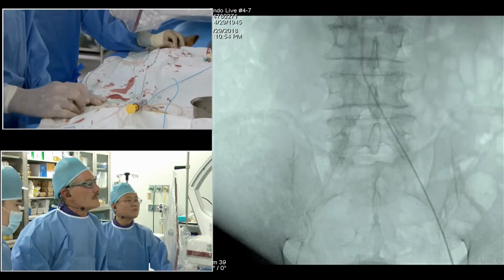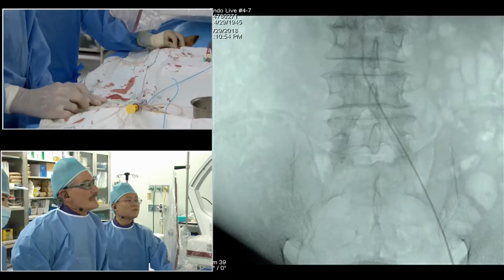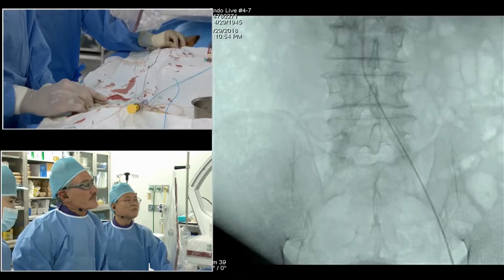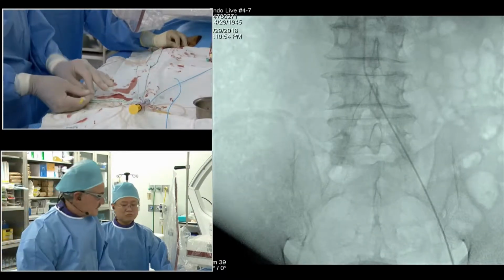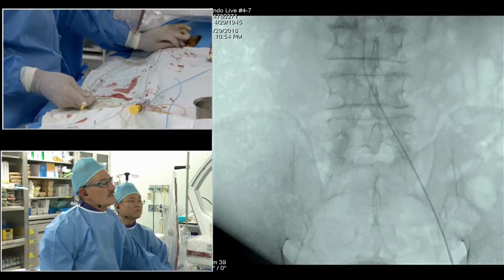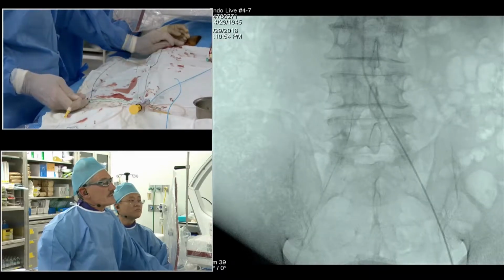After wiring, what kind of treatment can we use? I would say a covered stent here. This is a complex calcified total occlusion, TASC C to D. I think a covered stent would be a very good choice here. Nope, I see it's deviating again.